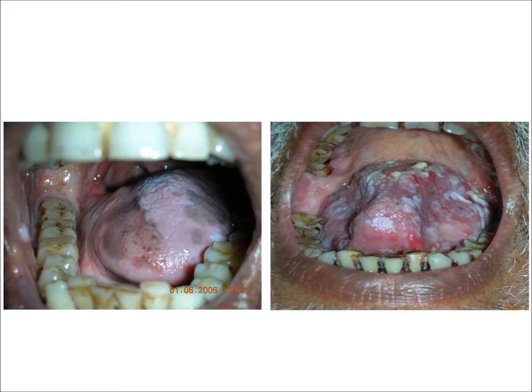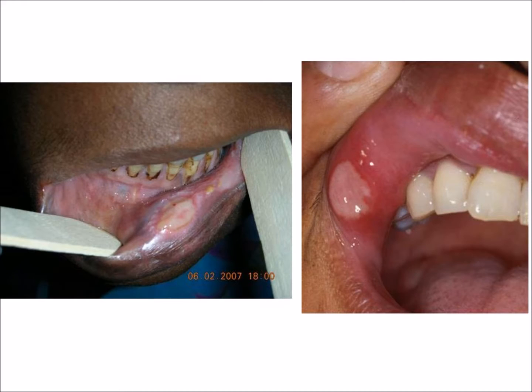Similarly, if you have a cauliflower-like growth in the upper palate, this is the typical appearance of a palatal cancer. Sometimes you have a white patch and red patch mixed in the gingivobuccal sulcus when you retract. This is a cancer which coexists with leukoplakia or a white patch. Here you see an infiltrative, ulcerated lesion, which is one of the forms of oral cancer.